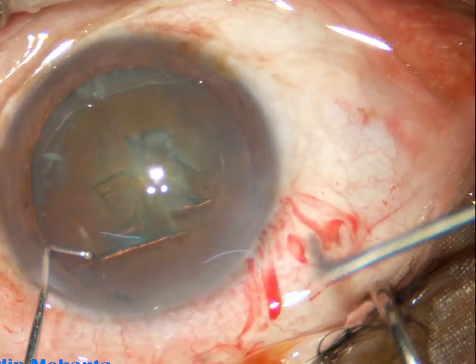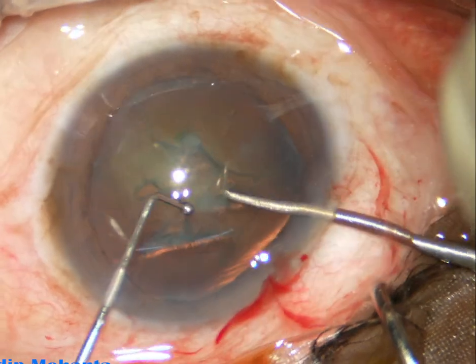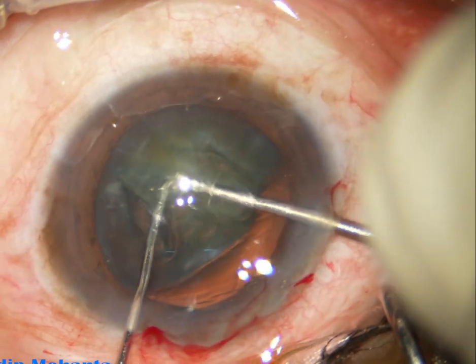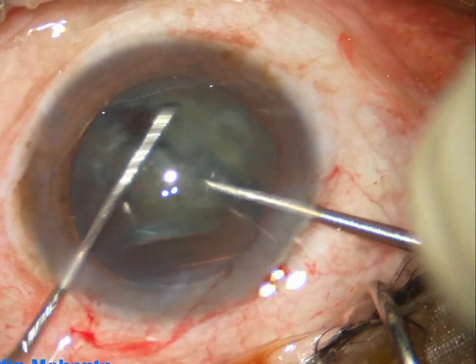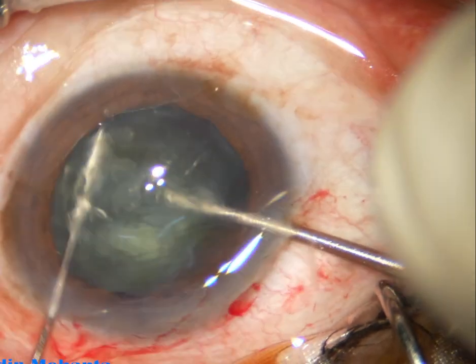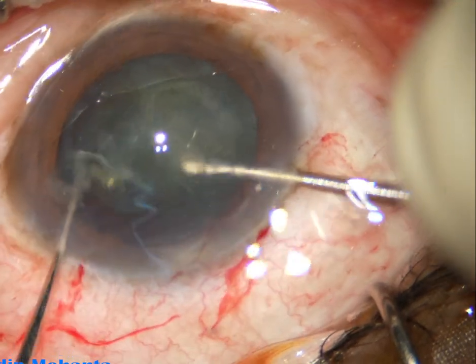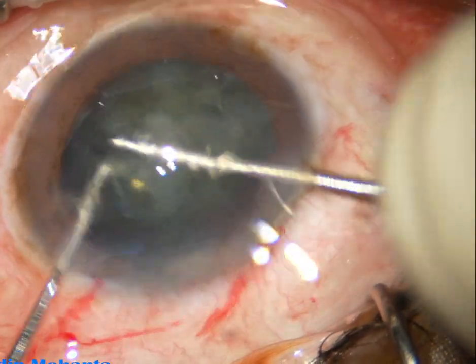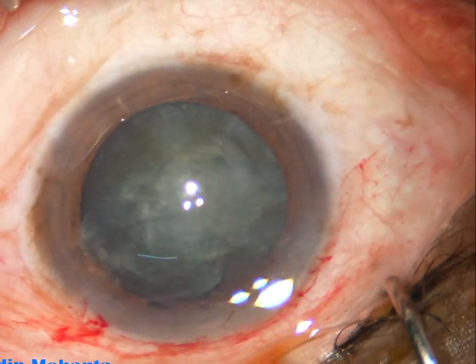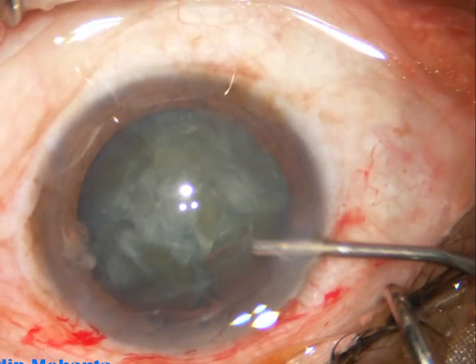Viscoelastic is again used to fill out the anterior chamber. Now this is a pre-chopper designed by me. The front edge is sharp, the back edge is blunt, and this is a ball-tipped sustainer. The nucleus has been divided into four pieces in just a few seconds.